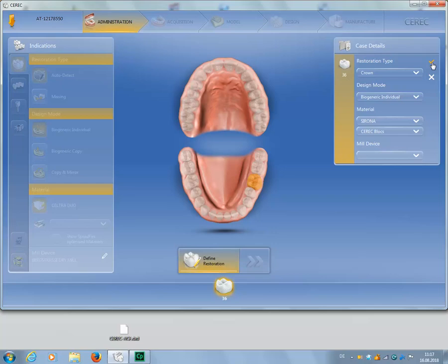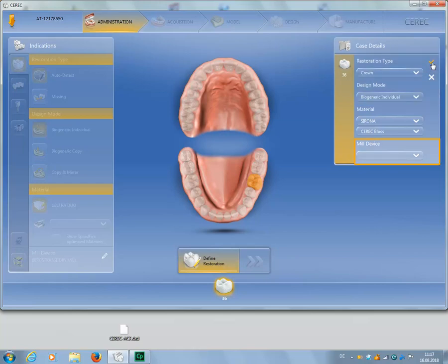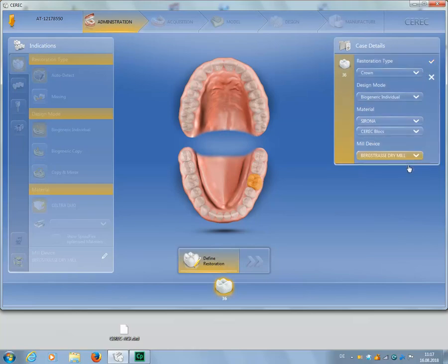The recommended restoration type is Crown, with the design mode Biogeneric Individual. We determine the grinding and milling unit, and confirm our selection by clicking the checkmark.